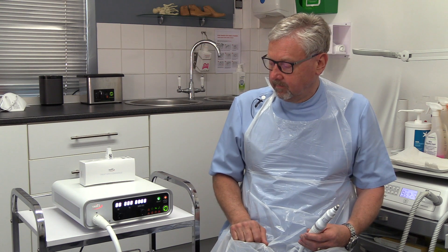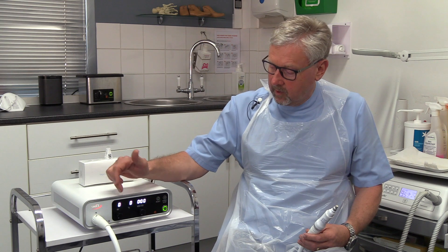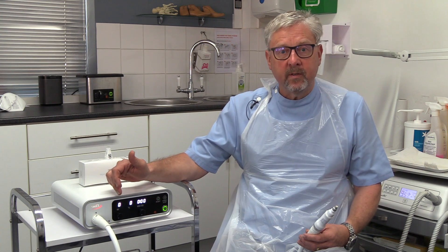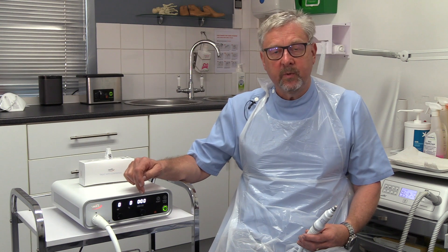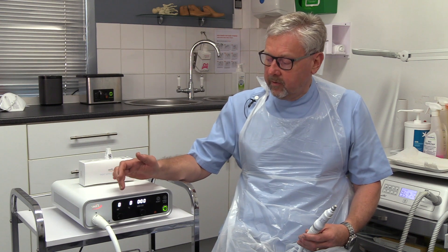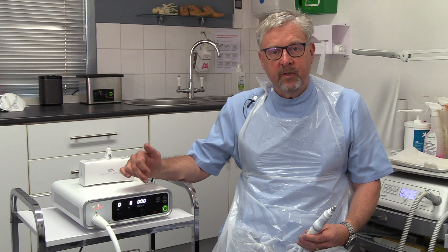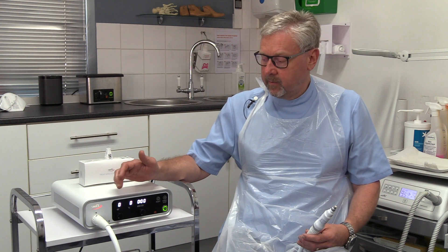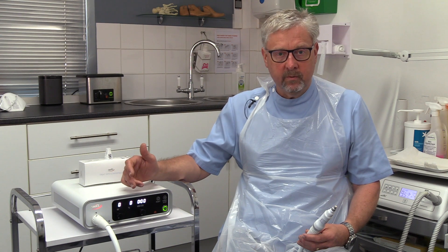When we use the machine, we have two settings. On the left here, we have the power setting, which is in watts, and on the right, we have the length of time that we apply it for, and that is normally two seconds. What you then do is multiply the two figures together for the amount of energy that has been put into the verruca. So if it was two watts for two seconds, it would be four joules. If it was ten watts for two seconds, it would be twenty joules.